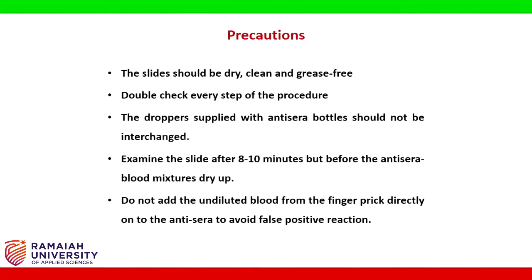Precautions: the slides should be dry, clean and grease free. Double check every step of the procedure. The droppers supplied with antisera bottles should not be interchanged. Examine the slide after 8 to 10 minutes, but before the antisera blood mixtures dry up. Do not add the undiluted blood from the finger prick directly to the antisera to avoid false positive reaction.